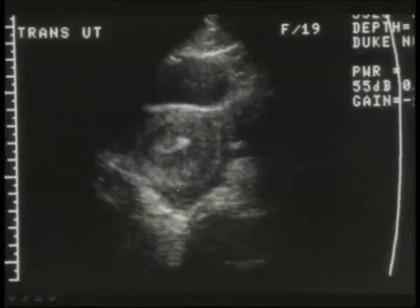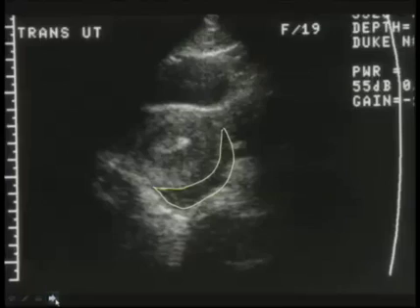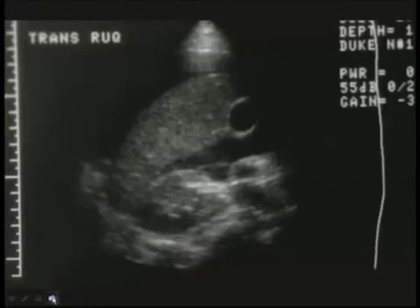Here's an example of free fluid. In this case, you see a relatively small amount of fluid here in the posterior cul-de-sac, but it does have low-level echoes. But there is an abundance of fluid up in the upper abdomen, to remind you and to warn you that the woman can have a lot of blood in the abdomen that is localized superiorly and will not be evident necessarily if you look only at the pelvis.